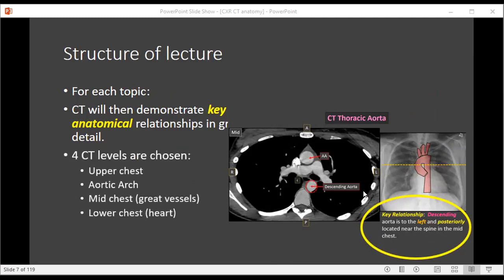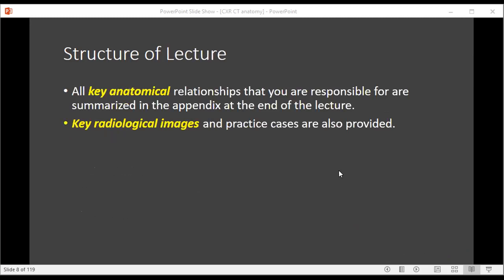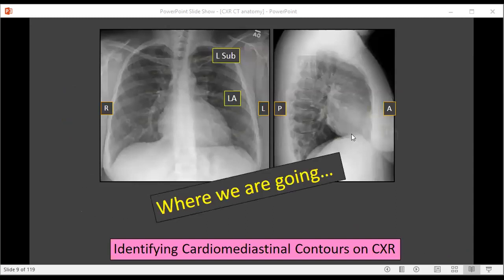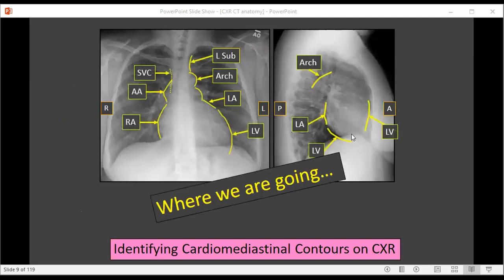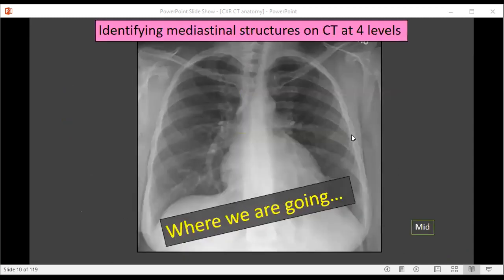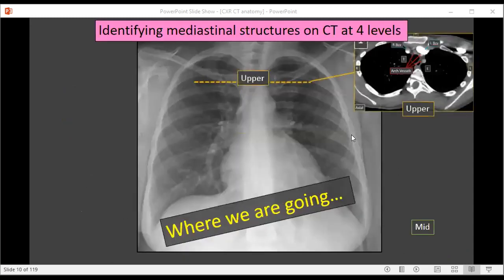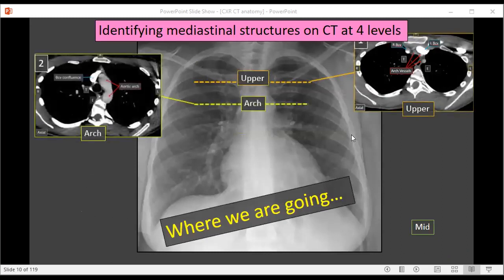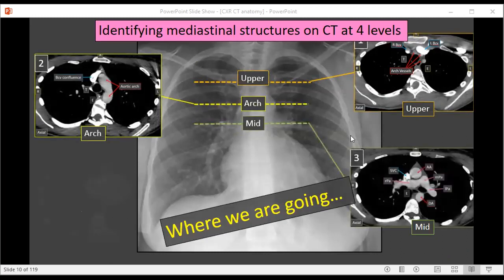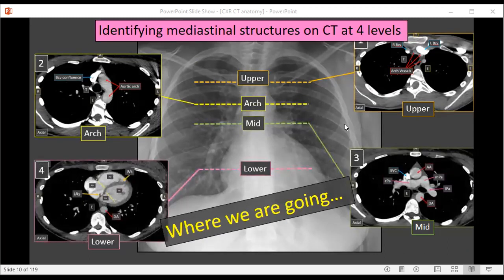Four CT levels are chosen: the upper chest, aortic arch, mid chest, and lower chest, and those are the only CT levels we'll be looking at. All key anatomical relationships that you're responsible for knowing are summarized in the appendix at the end of this lecture, as well as the key radiological images and the practice cases. So this is the frontal chest radiograph and these are all the contours that we're going to be covering in this lecture. Then we're going to be looking at four CT levels — the upper chest, the aortic arch level, the mid chest, and then the lower chest — and their relative locations on chest radiography.